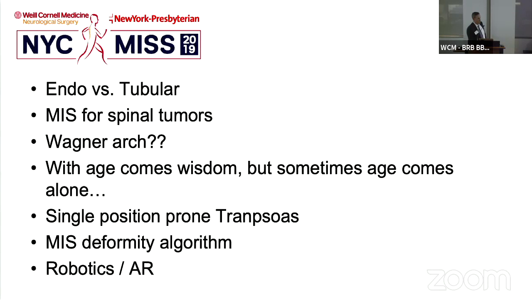And what they're doing is they're actually just rotating the spine, or they're moving the whole patient as they drop their hand, or they have entrance point shifts that they didn't realize are happening, and it looks perfect on the screen, but it's not actually going in where they thought it is. So I think that discourages people because they see a phantom screw placement that doesn't look that way in a post-operative CT, so then they stop trusting the technologies. But the technologies work, it's human error.